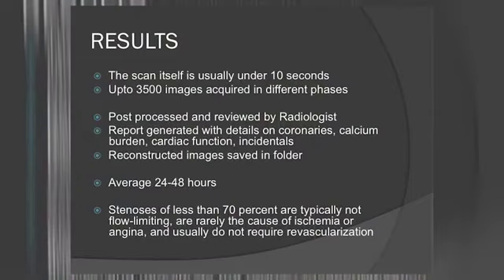Coming next to results. Once the exam is done, and I wanted to stress this, 10 seconds. The proper scan, because like I said, it's a sophisticated machine which is very fast. The proper scan, a CCTA, is 10 seconds, okay?